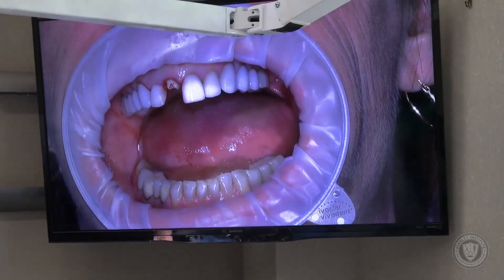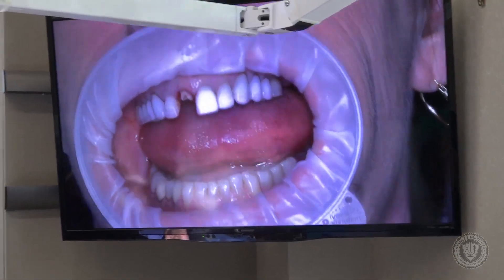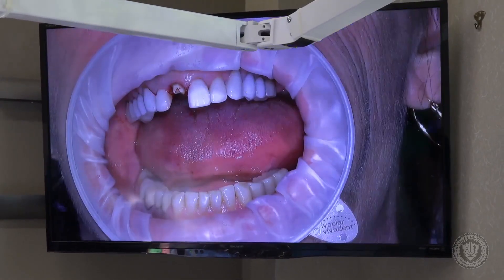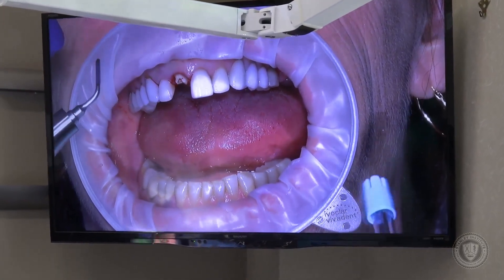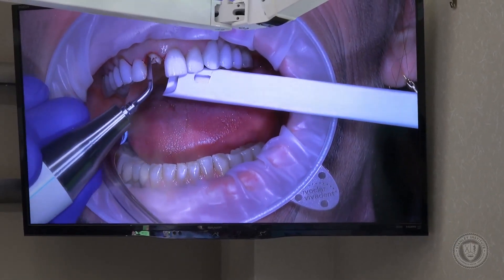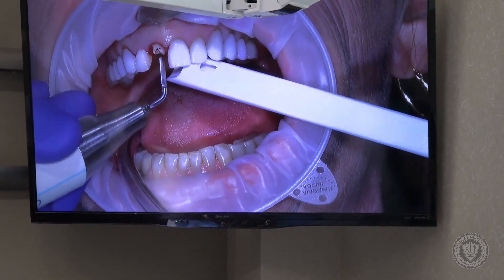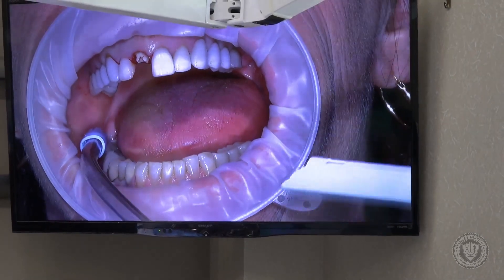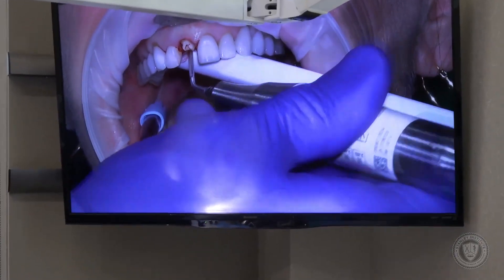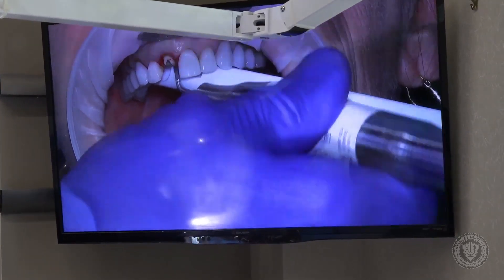Now we want to do an atraumatic extraction. If you don't have this particular instrument in your arsenal and you're doing anterior aesthetic work, you definitely want to consider it — it's called the Cube by Axion, and it's a piezo, a piezotome. We've placed a nice piezo tip on here. We're going to start on the palate. Normally we'd do mesial, distal, palatal — we never want to do it on the facial because we don't want that buccal bone to melt away. But in this case, because I really want to maintain the papilla, I'm starting on the palate, and if that's enough, we'll stop there. The best way to use this instrument is once you get a purchase point and step on the actuator, just rock it back and forth and let it seep down beside the root.